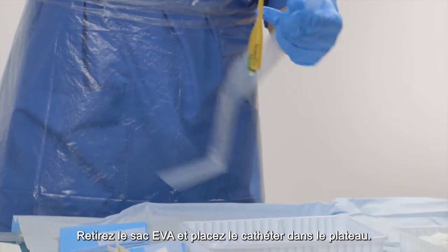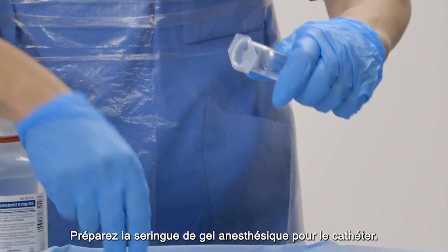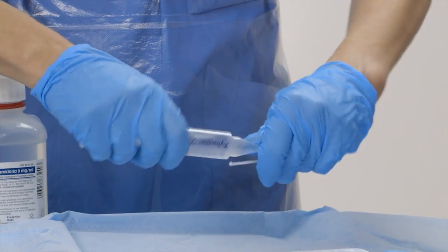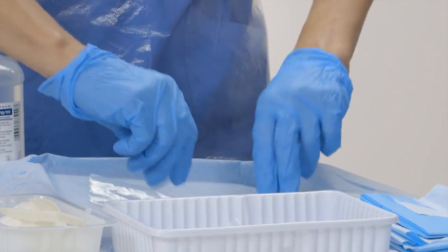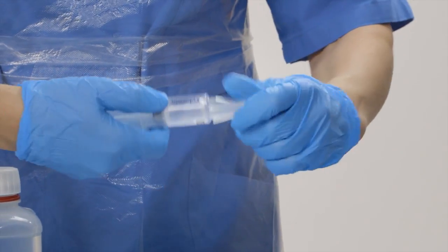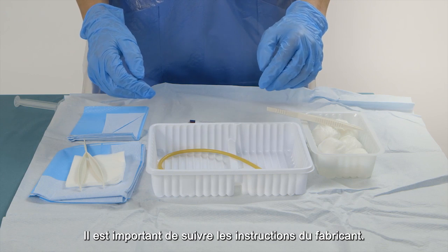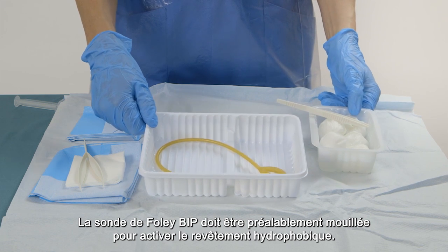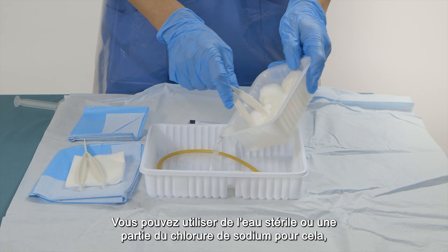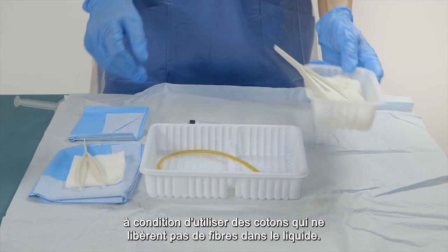Only now put on the sterile gloves. Remove the eva bag and place the catheter into the tray. Prepare the anesthetic catheter gel syringe. It is important to follow the producer's instructions. The BIP foley catheter should be pre-wetted to activate the hydrophilic coating. You can use sterile water or some of the sodium chloride, as long as you use cotton pads that don't release any fibers into the liquid.